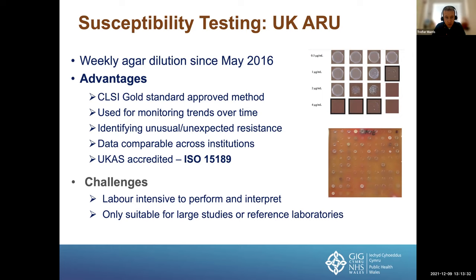There are challenges, as Gunnar and Audrey have highlighted. It is very labor intensive to perform and interpret, and it's only really suitable for laboratories such as ours, who have the benefit of enough organisms to make it viable. It was never intended as a routine method. So much more suited to our kind of setup. Next slide, please.